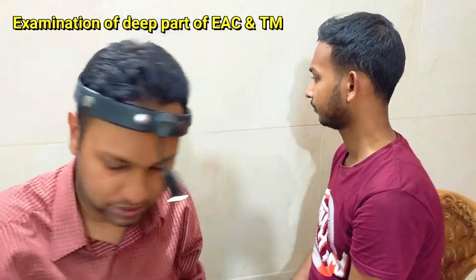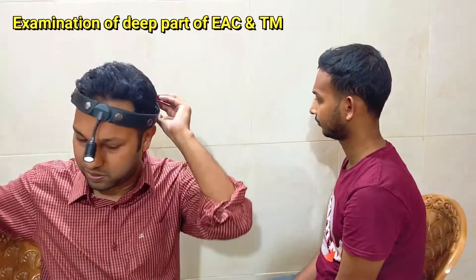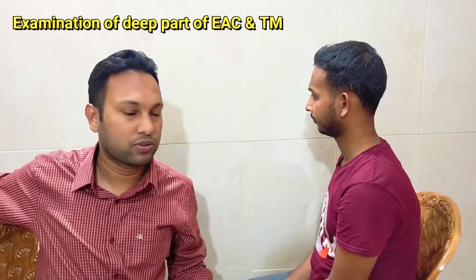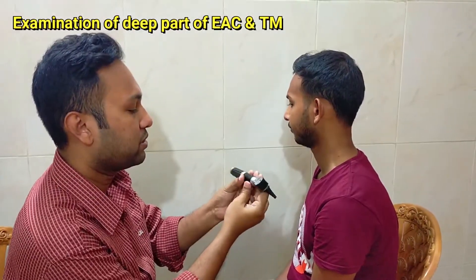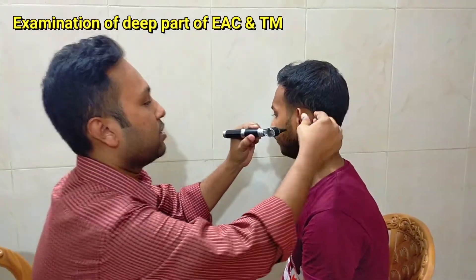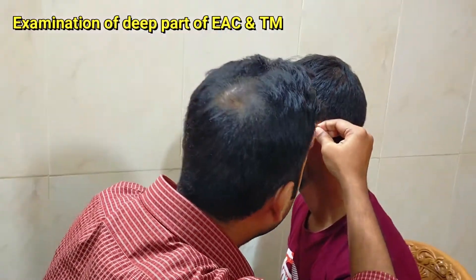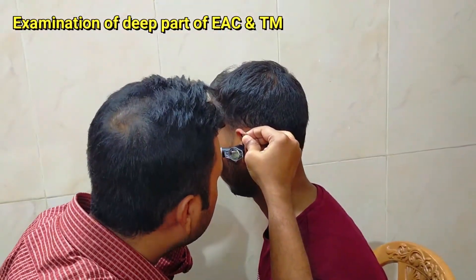The aural speculum findings can then be confirmed by otoscopic examination. In the case of examination of the left ear, the otoscope is held by the left hand in a pen-holding manner. Then with the right hand, the ear is retracted upwards, backwards, and laterally to make it straight.